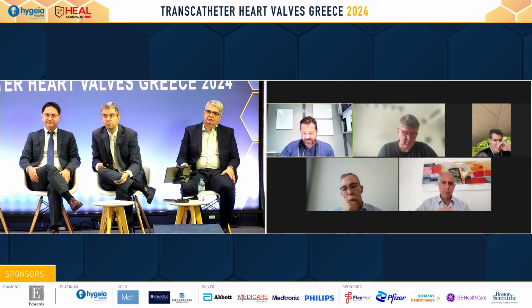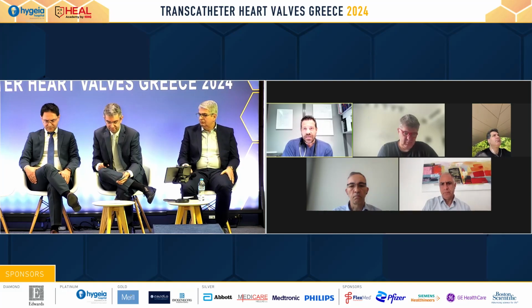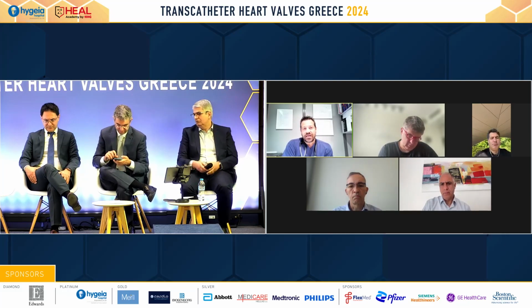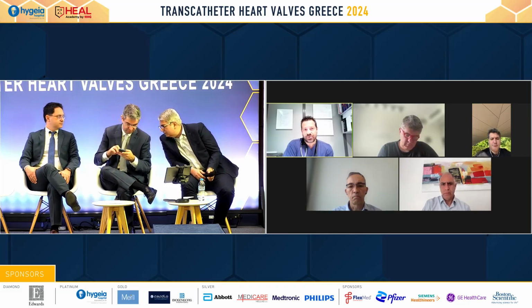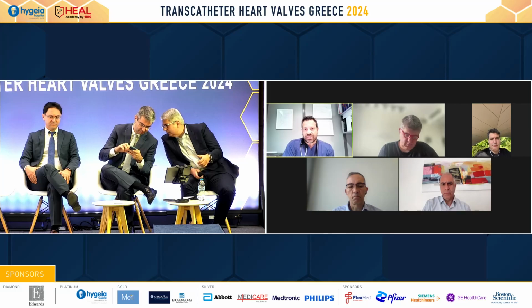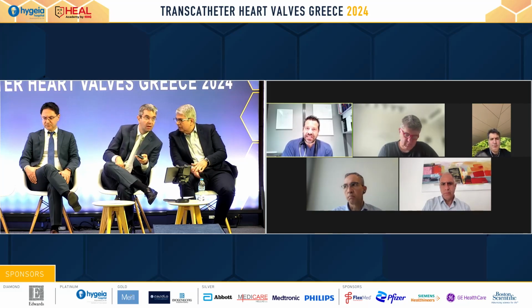And my question for Professor Pibarot is, in the real world, which patient will you reject from mitral TEER? Considering that even though we might not change the prognosis of the patient, we certainly reduce the hospitalizations.